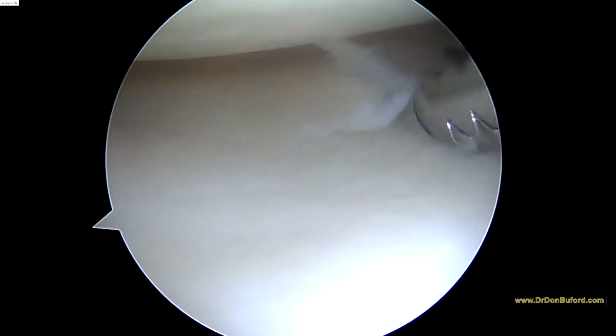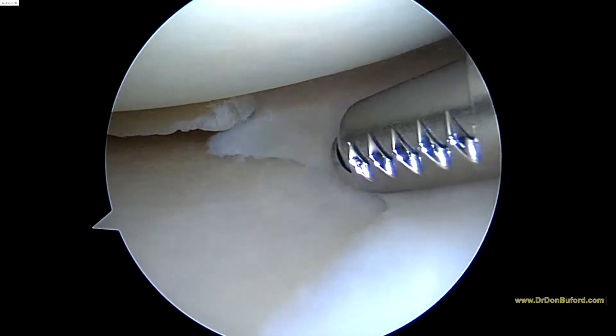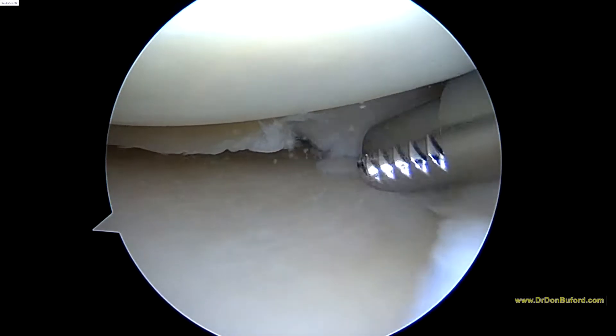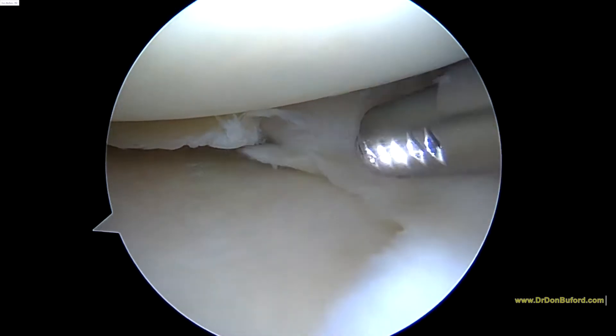With our shaver, we can really identify the tear a lot easier for this section. You can see the torn edges right there. So this is a good example of what we call a white-white tear in the meniscus — it's in the avascular part of the meniscus.